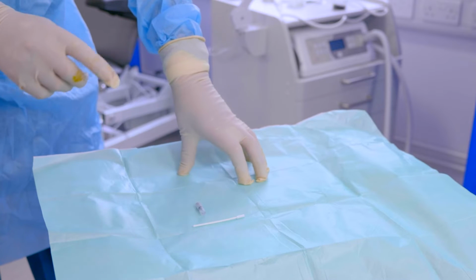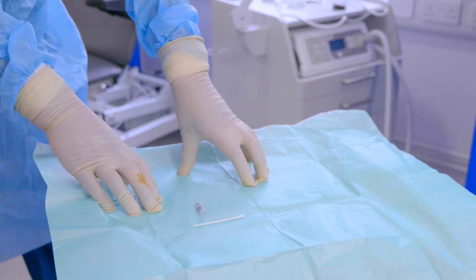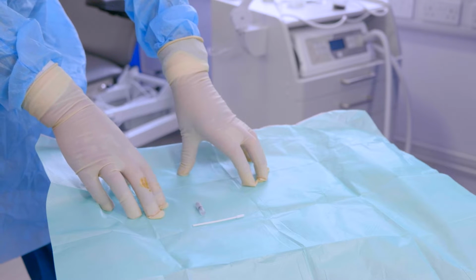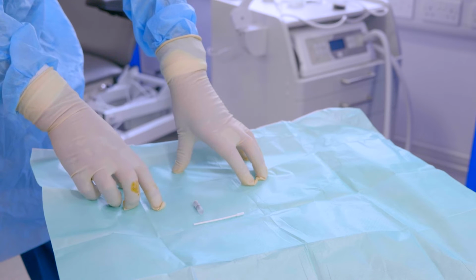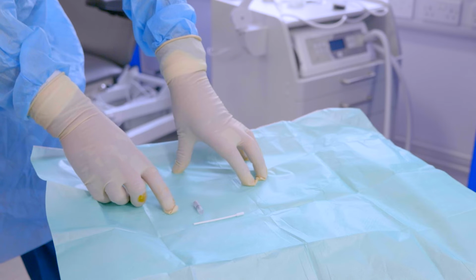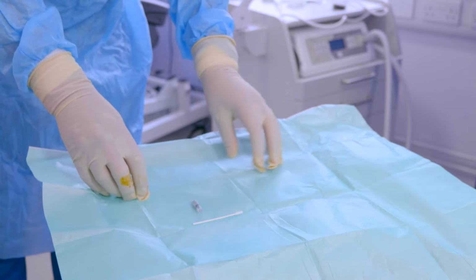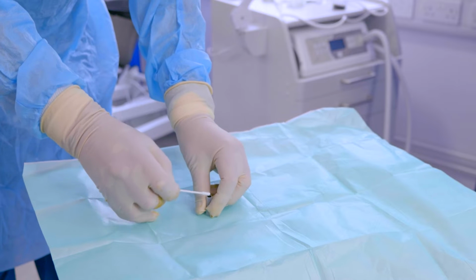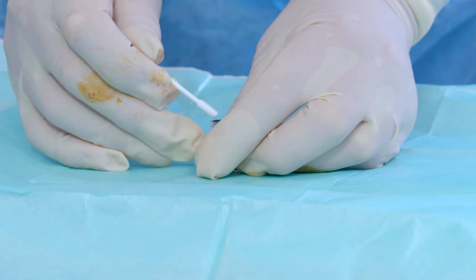So, having removed the toenail, now we have to destroy the nail matrix. To do that, we're using a Swab-It. I've used these for approximately 15 years and find them so easy to use and so safe. It contains 0.2 of a mil of phenol only. Because of the various alerts you've had, the recent one, you want to use as little phenol as possible because of the vapor that is released from the chemical. This is a Class 2A medical device and the only product licensed to do this work currently.